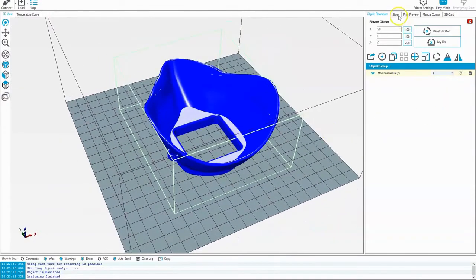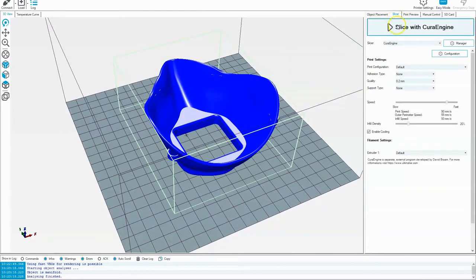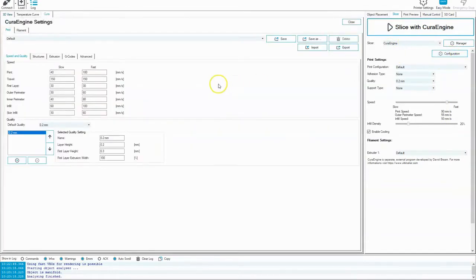And I'm going to now start working through the slicer options. To do that, go to the slicer tab at the top of the selector here. Now we just want to work down through and set up some of the basic settings for printing with PLA. I always recommend starting at the top and working your way down. So Cura Engine is the slicer. We're going to go to the Configuration tab, and we're going to come around here and take a look.